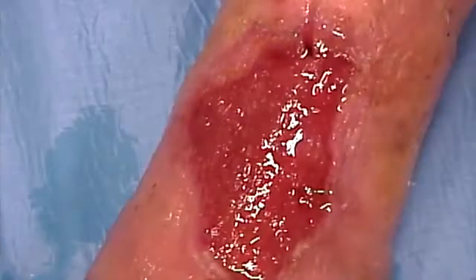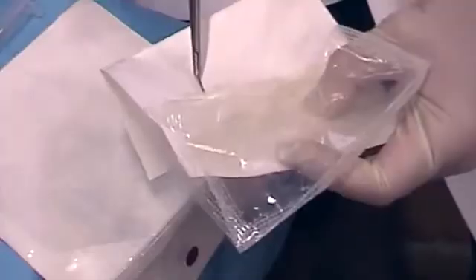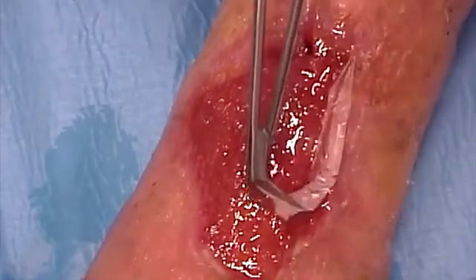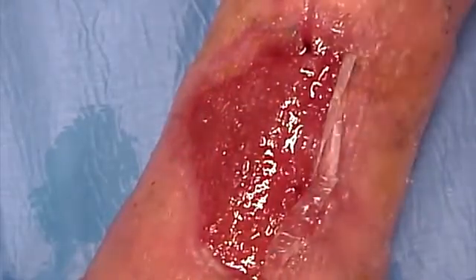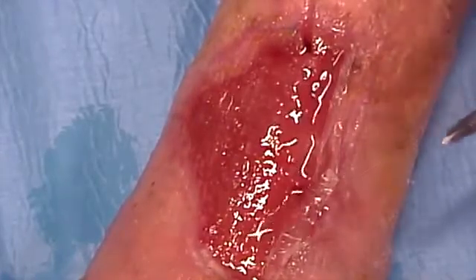Once the connective regeneration phase is completed, the next step is re-epithelialization. In the integrated method, epithelial regeneration is aided and accelerated by applying various segments of Genix EGI collagen membrane to the edges of the wound, adapting them to the shape of the wound. The membrane is irrigated with plenty of saline solution to make it more malleable and adaptable to the lesion.